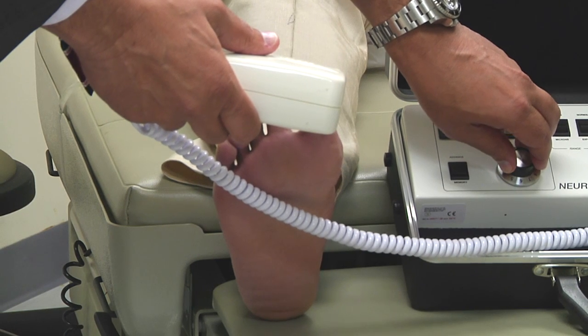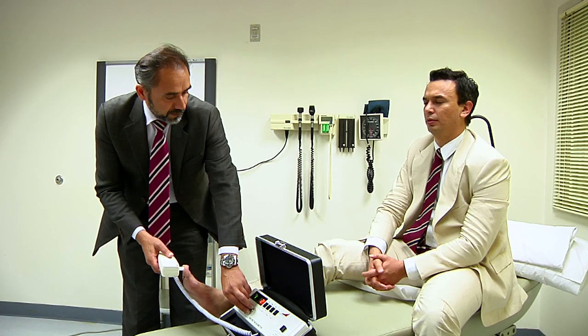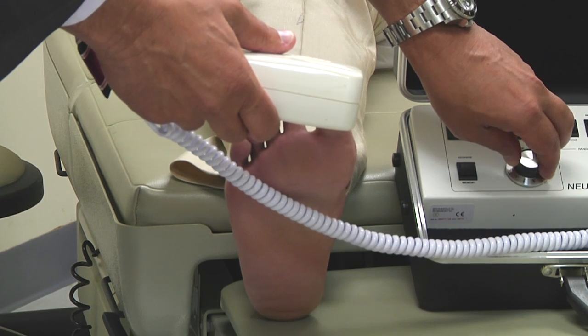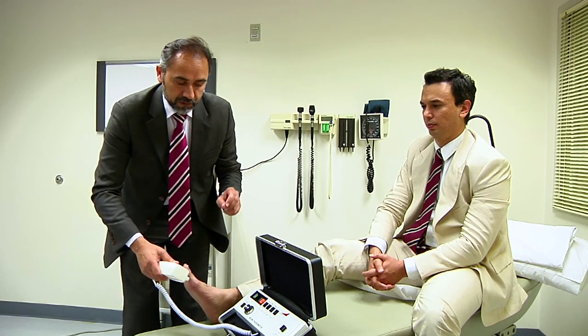Okay? And again, now. Okay, and again, now. Okay, so that's 3 times we've assessed that, and we get an average of the vibration. Now, of course, this is normal, and this was 6 volts. But in people who have diabetes and diabetic neuropathy, their voltage will be much higher, and we can put them at different risks of diabetic neuropathy and foot ulceration.